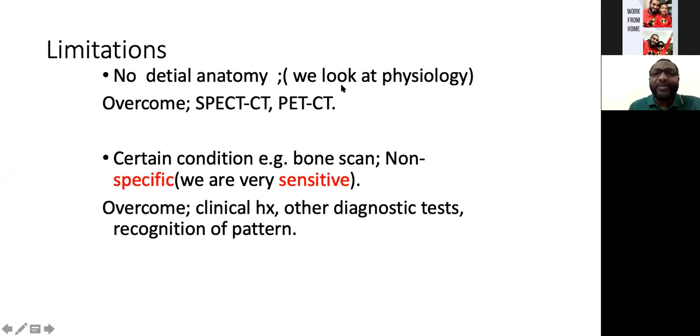So sometimes we struggle, particularly in smaller areas in the vertebrae, I will show you in my subsequent slides, and areas in the brain and smaller tissues, and sometimes we struggle. So we are not anatomical.